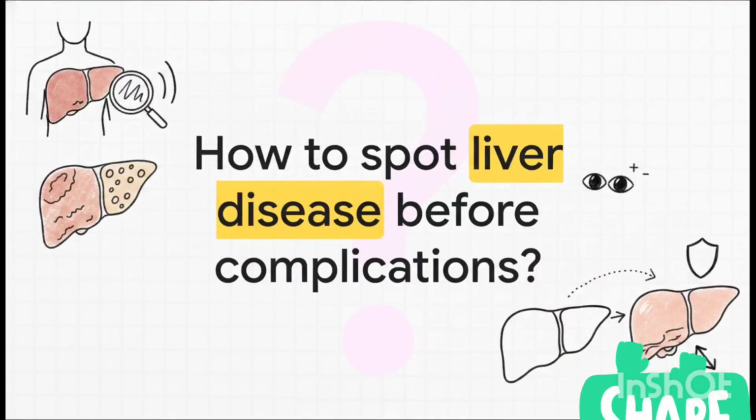So, how do we identify liver disease before serious complications develop? Honestly, as radiology students, this single question is the entire reason you're training your eyes right now. You guys are right there on the front lines of early patient diagnosis. Whether we're talking about fatty liver, cirrhosis, cysts, or tumors, early detection relies entirely on your ability to spot those tiny deviations from a healthy scan. If we can see those subtle changes early on, well, we can step in way before the damage becomes irreversible.